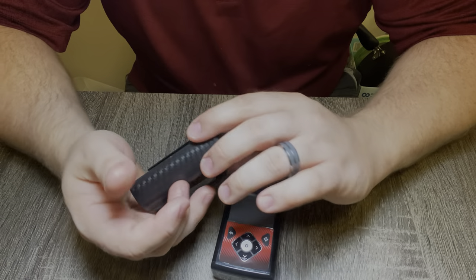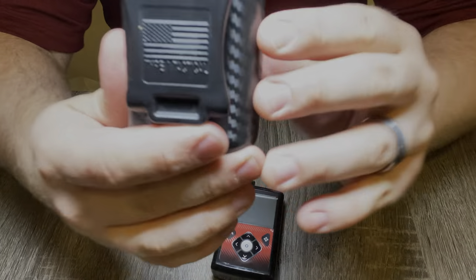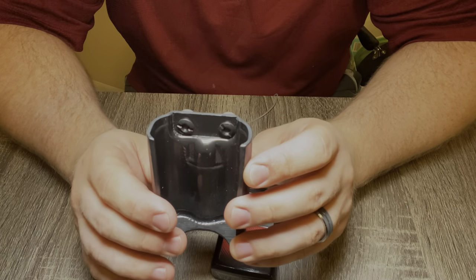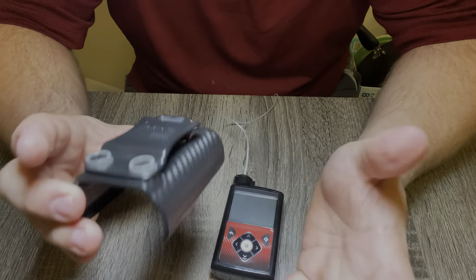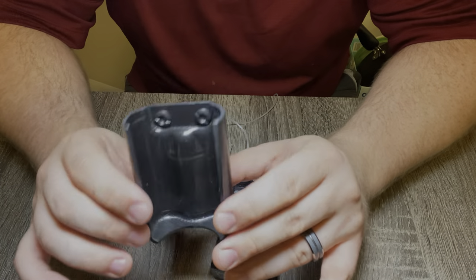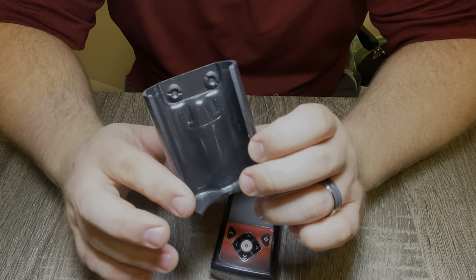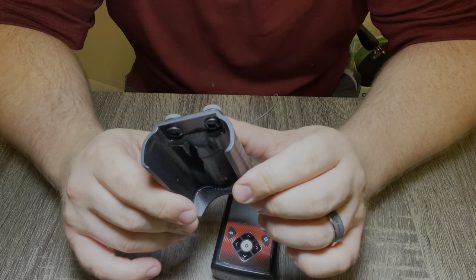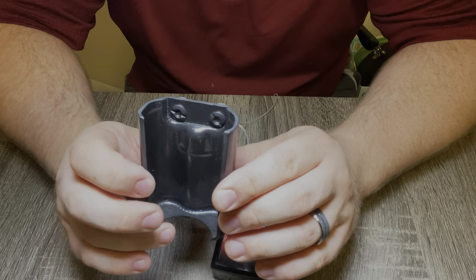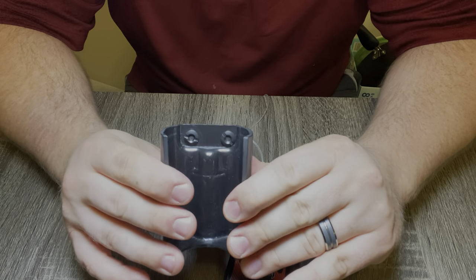So the first piece of gear I'm going to talk about is my holster from Type 1 Tactical. This thing is awesome — I've had a chance to use it for a long time and it's holding up. It's sturdy, it's not falling apart, and the screws that hold it in are still solid. I run this case on my belt and I just feel super confident with this versus the little belt clip that the pump came with. It keeps it a lot more secure, a lot more snug.